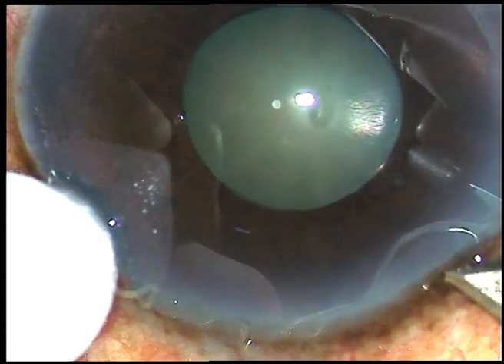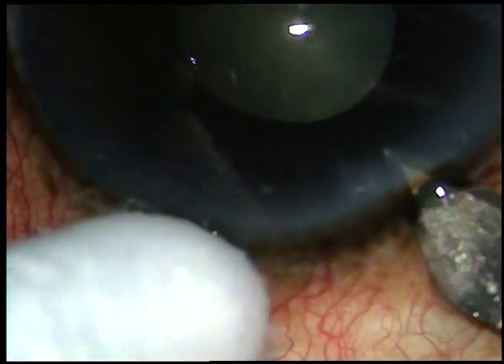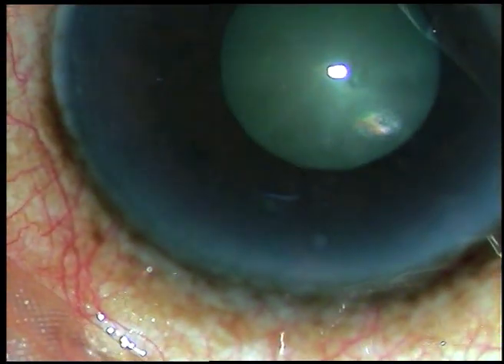Dear colleagues, this is a cataract with grade 3 nuclear sclerosis and small pupil. The patient is one-eyed and I don't want to take any risk in this case.